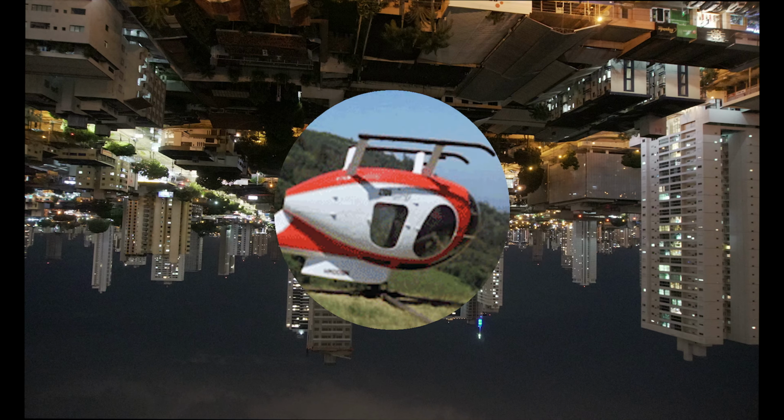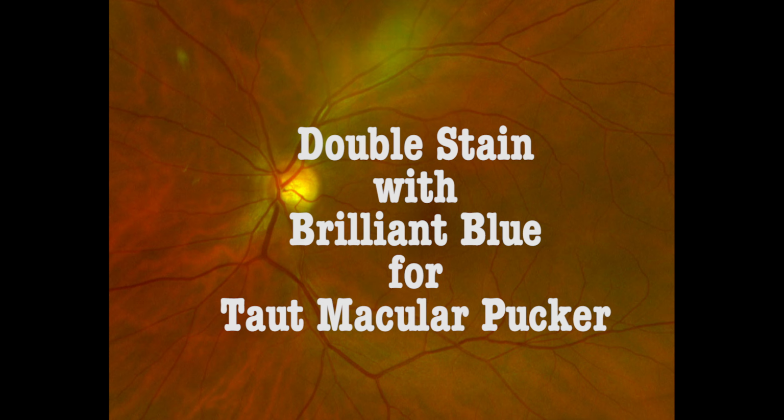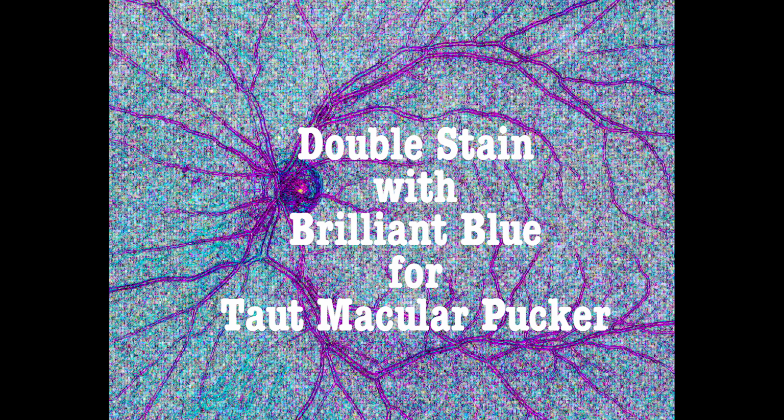This is inverted vitrectomy. Double stain with brilliant blue for taut macular pucker. This is the preoperative OCT showing a very adherent and taut macular pucker with a large traction.